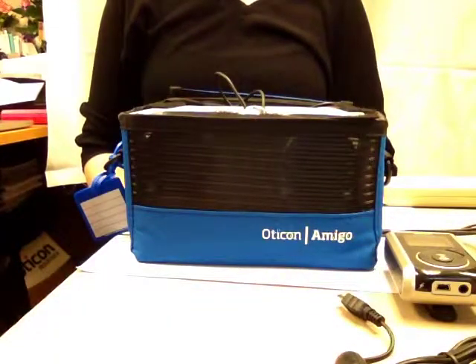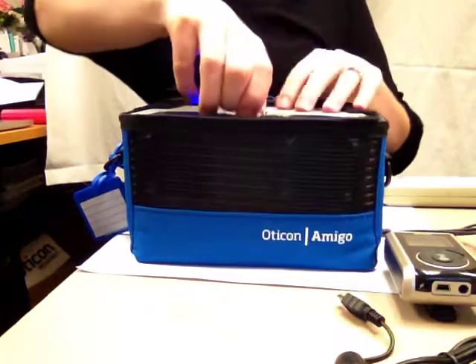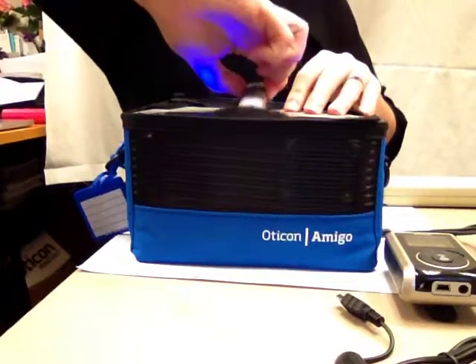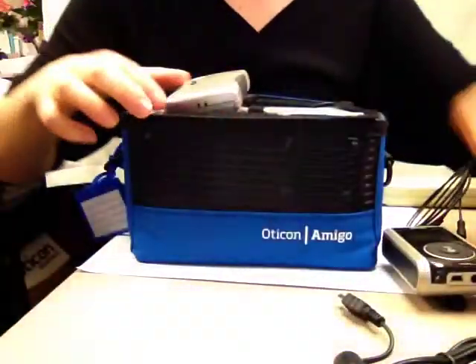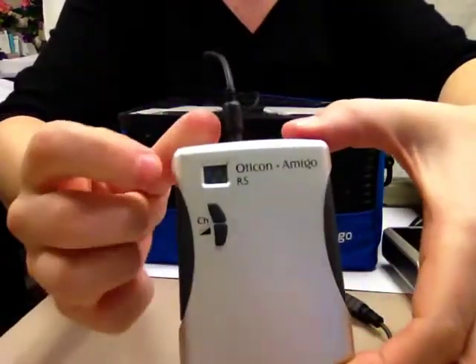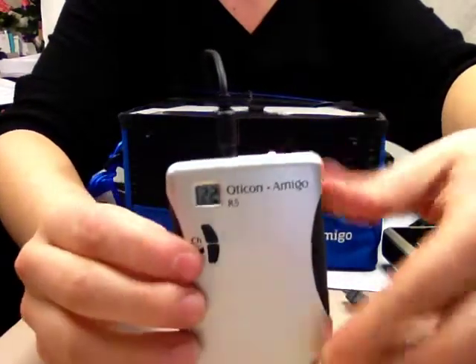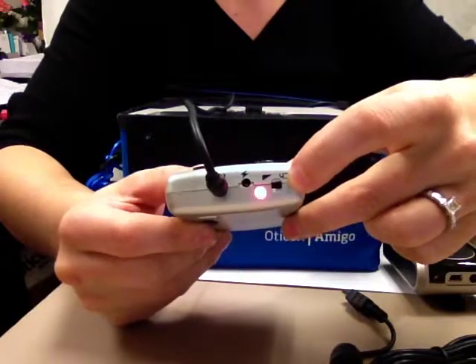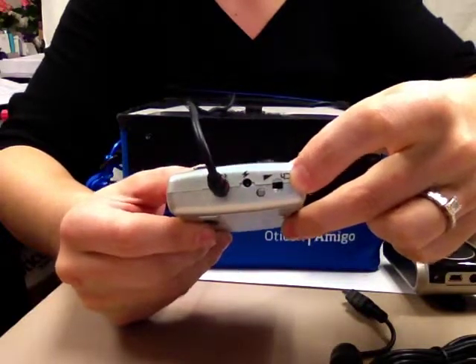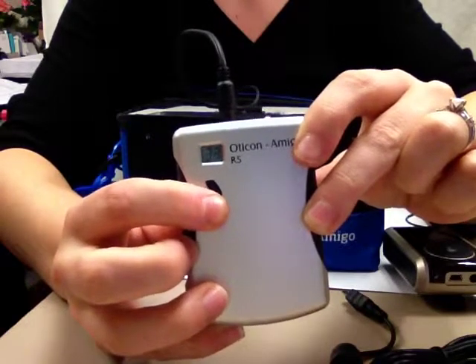If you still don't hear your voice, make sure the transmitter and the receiver are on the same frequency. The number on the screen is the frequency of the transmitter. The receiver should have the same number on its screen. If the numbers don't match, you can change the frequency of the receiver by sliding the channel button on the top of the receiver to CH and using the plus and minus buttons below the screen to change the frequencies.